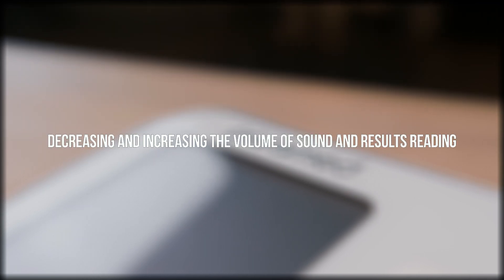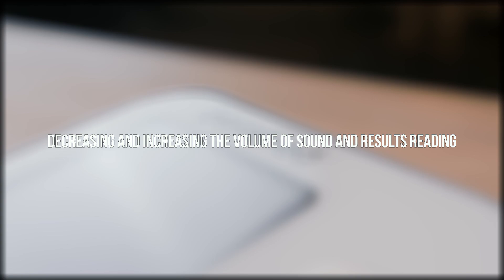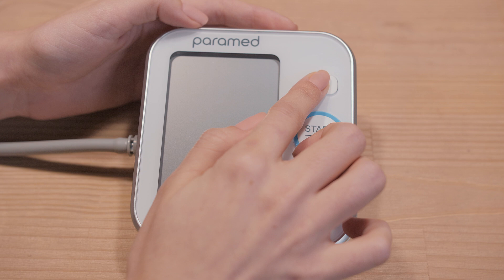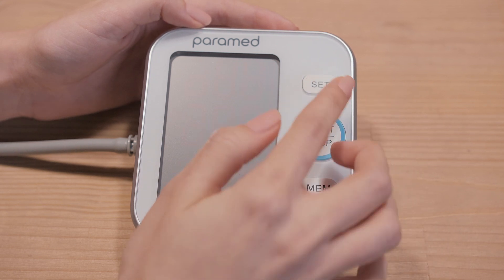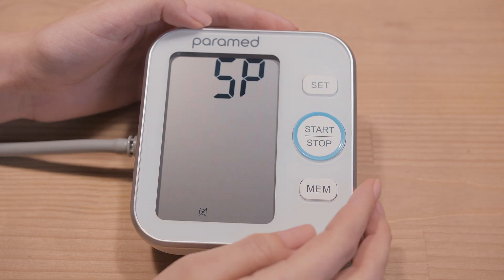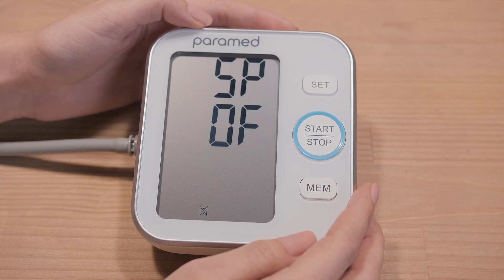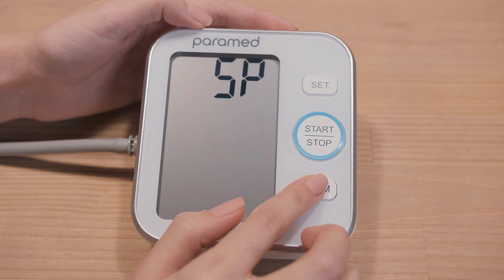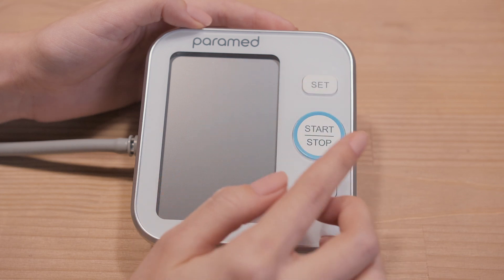4. Decreasing and Increasing the Volume of Sound and Results Reading. While the screen is off, press the Set button for more than 3 seconds. Press Set several times until the SP symbol and a digit appear. Each digit is the level of signal volume — the higher the value of the digit, the higher the volume. To increase or decrease the volume, press MEM several times. To save, press Set and then the Off button.